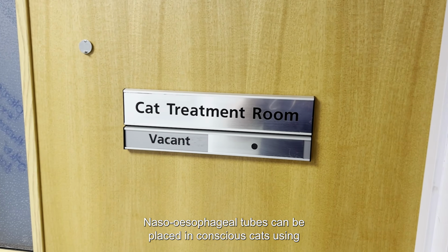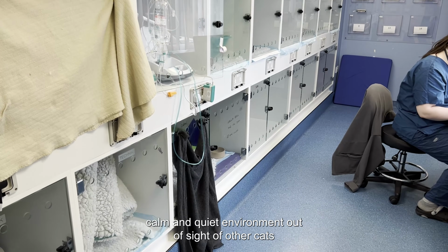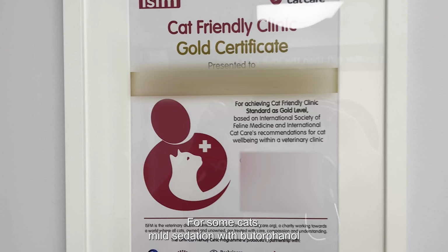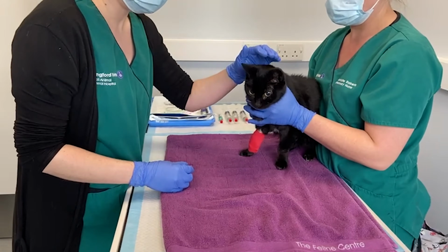Naso-oesophageal tubes can be placed in conscious cats using cat-friendly handling principles, such as a calm and quiet environment out of sight of other cats and dogs. For some cats, mild sedation with butorphanol or gabapentin, for example, could be used.